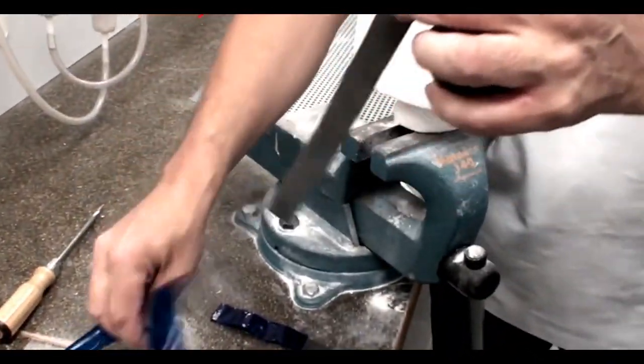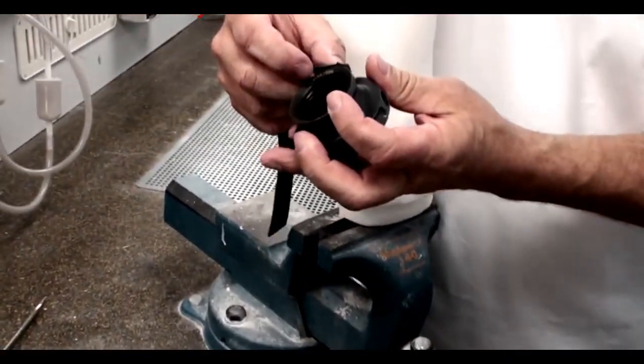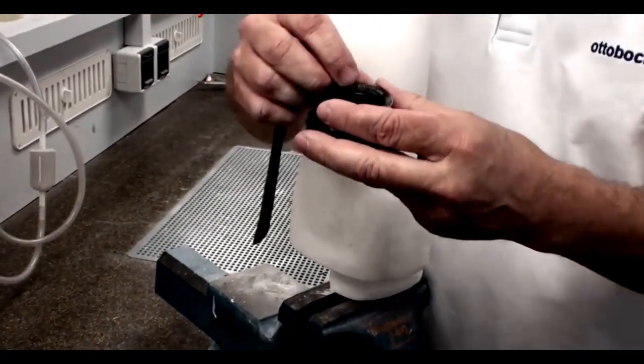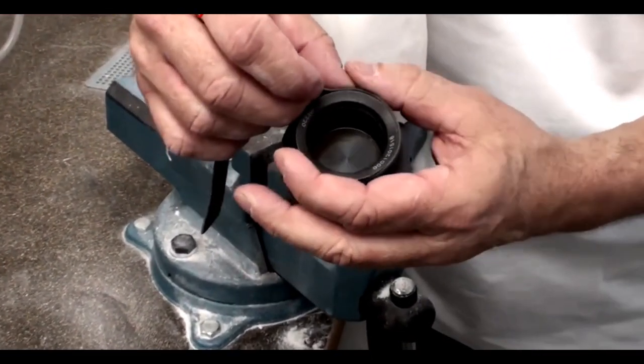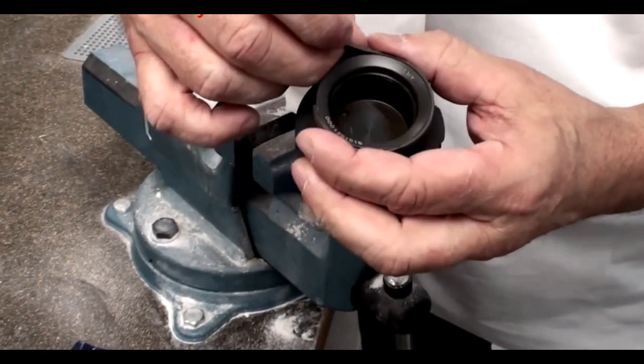Now you need to prepare the DVS pump. Take plastic band and put it around circumferentially. And this will help create a seal with the thermoplastic check socket material.